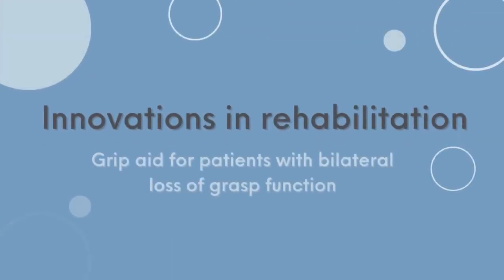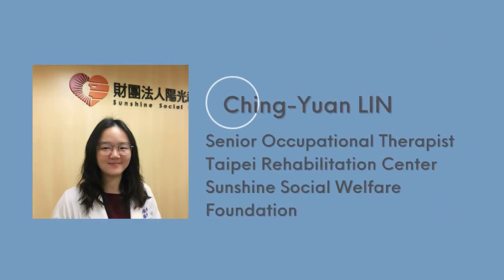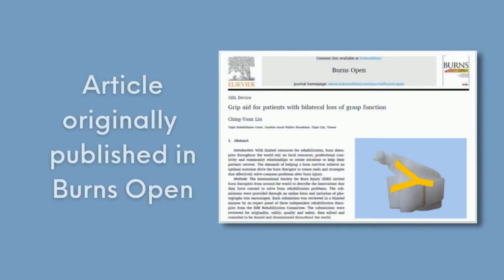In this series on innovations in rehabilitation, we'll demonstrate how to make a grip aid that can be used by people who lost function in both hands. This innovation was prepared by Qingyuan Lin, Senior Occupational Therapist at the Taipei Rehabilitation Center of Sunshine Foundation. It was originally published as an article in Burns Open.